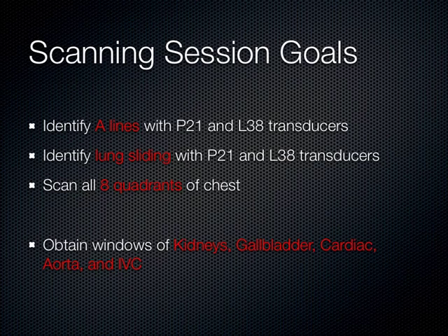The P21 probe is a cardiac probe. You can see deeper, and the pleural line's going to be way at the top of the screen, so it's not going to give you the detail, but it gives you also an idea of whether any B lines are better seen with the P21 probe. So go back and forth between probes, but for pneumothorax, you definitely want to use the high frequency probe.